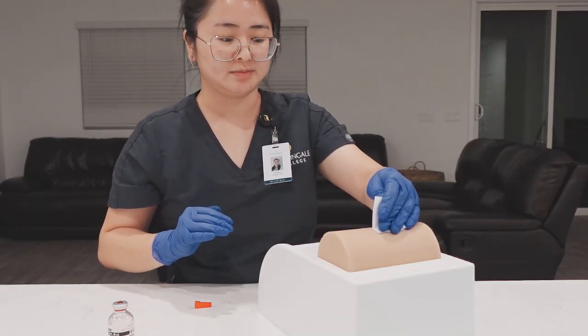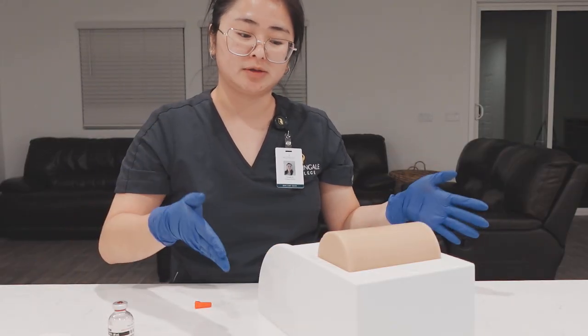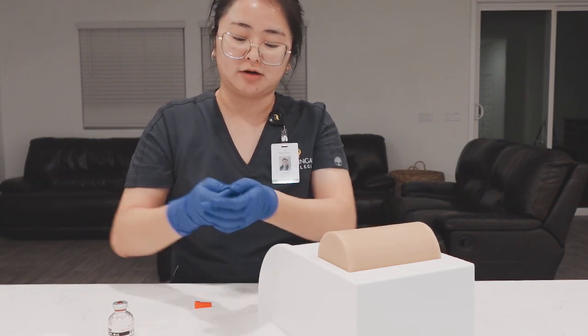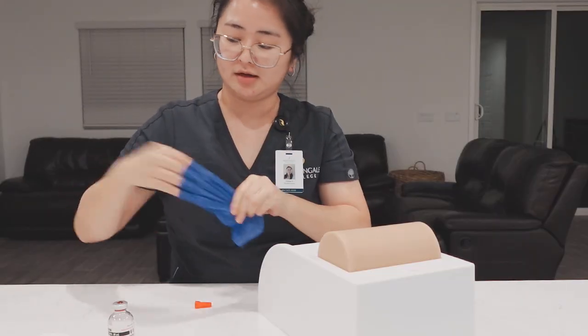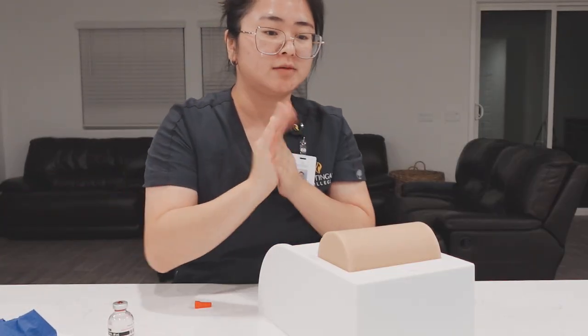We're going to check if there's bleeding. There's no bleeding, so he is okay. I'm going to make sure my patient's comfortable. I'm going to clean up my area, and I am going to take off my gloves. Throw all this away, come here, do hand hygiene, and document my procedure.